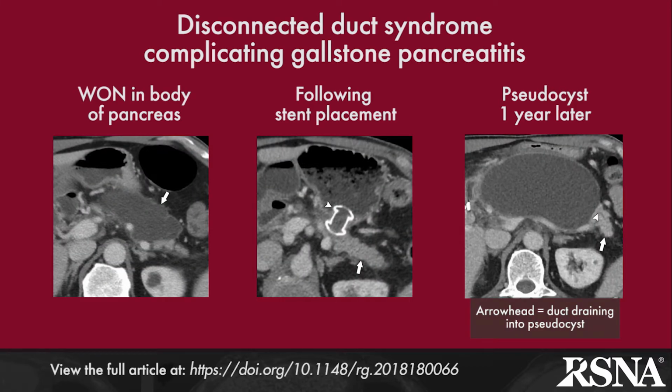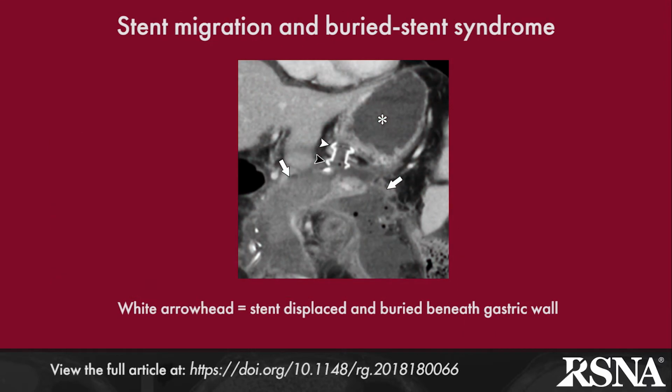Disconnected duct syndrome, which complicates up to 1/3 of patients with necrotizing pancreatitis, has characteristic imaging features at CT and is important to recognize.